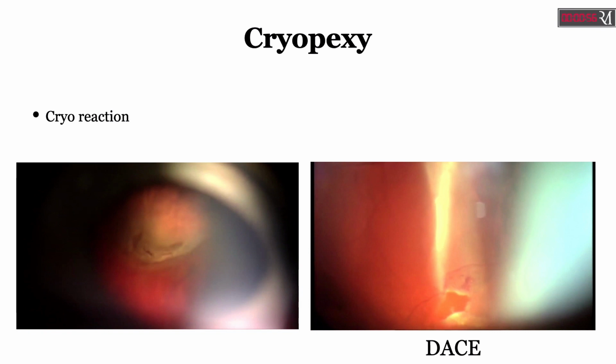The second tool we can use before injecting the air is to start doing the drainage with a very small sclerotomy without injecting the air. While you are indenting, this will allow more of the fluid to egress out from this sclerotomy, and by now you can reach without injecting the air, which may hinder your vision during the procedure.